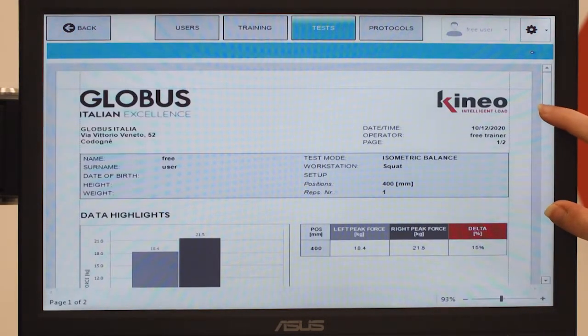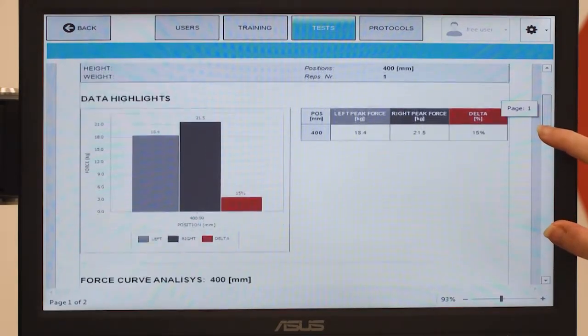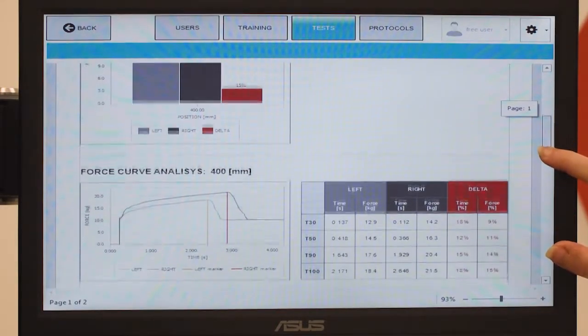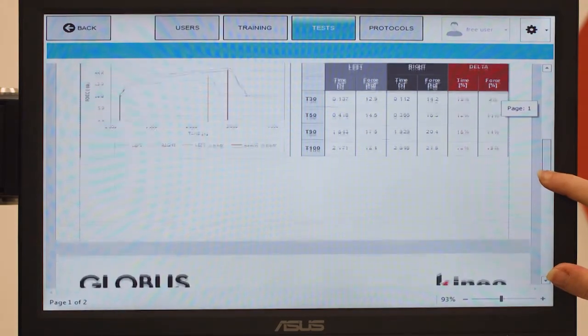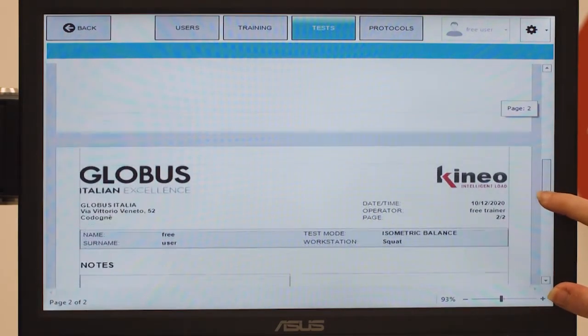The curves analysis allows you to graphically analyze the data collected in terms of strength and seconds at 30%, 50%, 90%, and 100% of the isometric max strength values respectively.